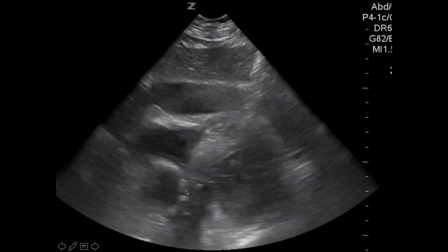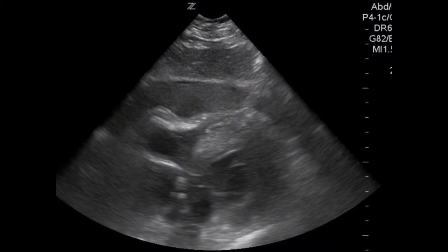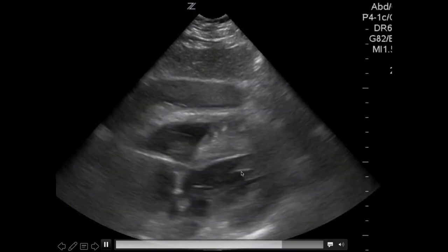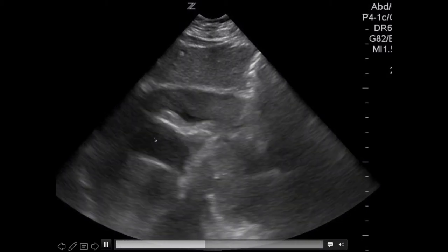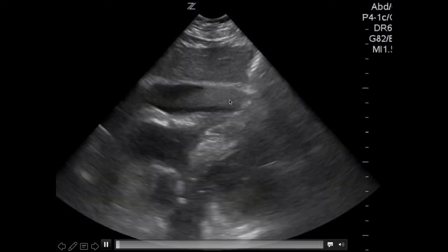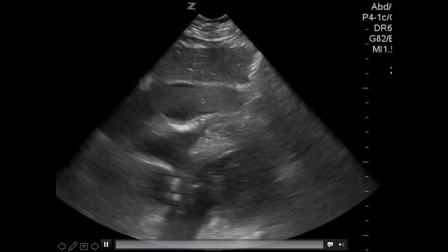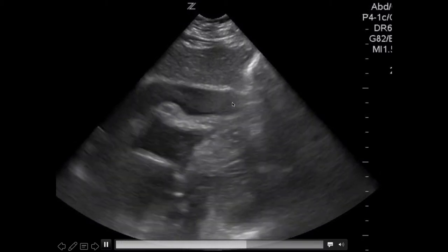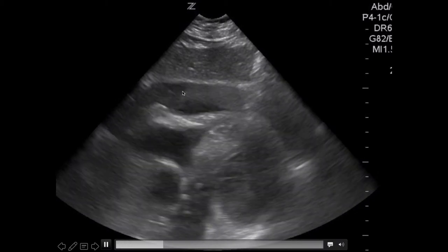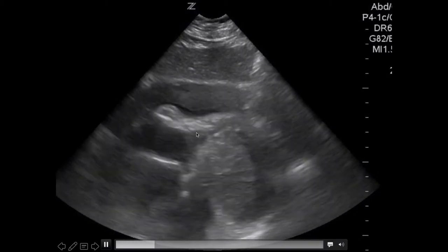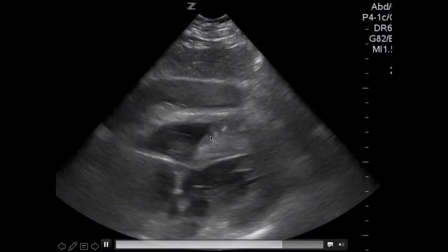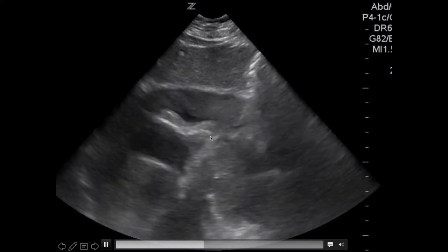Let's repeat the cardiac ultrasound. Everyone should say uh-oh - we have liver, right ventricle, left ventricle, right atrium, left atrium. This is now a rather large pericardial fluid collection - it is not simple, it is complex. There is gray stuff swishing around inside: that is clotted blood. Clotted blood in the pericardial sac is a very bad thing - it will squish the right ventricle so it cannot fill with blood, backing up blood. That's why we call it obstructive shock. This patient is in cardiac tamponade.